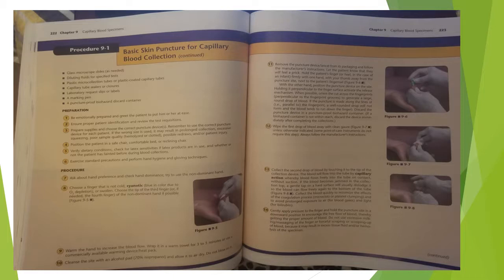If the puncture is made along the lines or parallel to the fingerprint, a well-rounded drop will not form and the blood tends to run down the finger. Discard the puncture device in a puncture-proof biohazard container. If a biohazard container is not within reach, discard the device immediately after completing the collections.